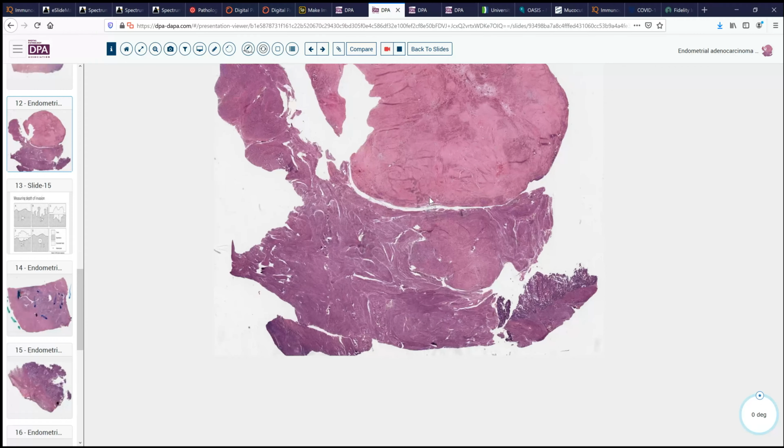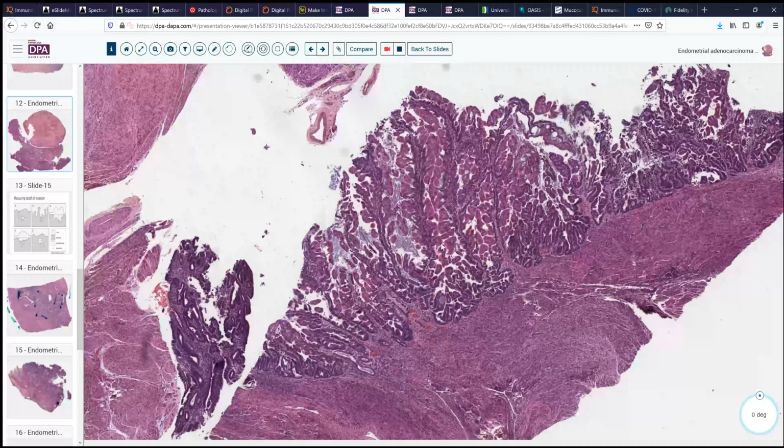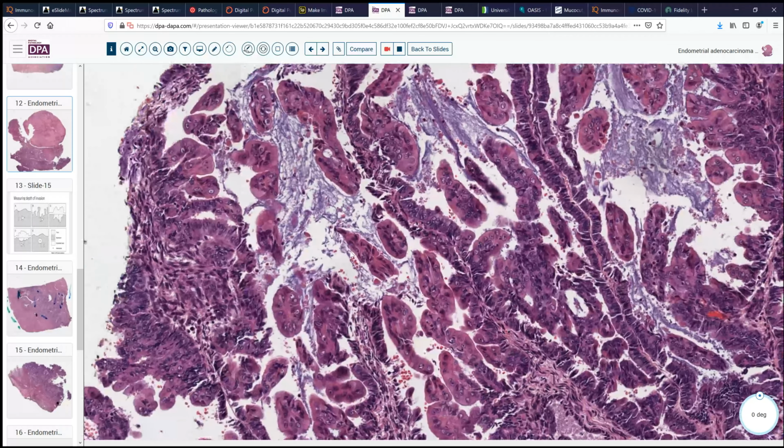Now, pattern is important, and this tumor gives us another issue of some challenge sometimes. It again appears like we're very superficially invasive. This is a tumor that's composed of large glandular structures with a very prominent intraluminal micropapillary appearance. So this is a common conundrum. Do we see this as then micropapillary serous carcinoma? Do we consider that as the concern here? Well, again, this is where nuclear grading is helpful to you, because these nuclei are not grade 3 nuclei.